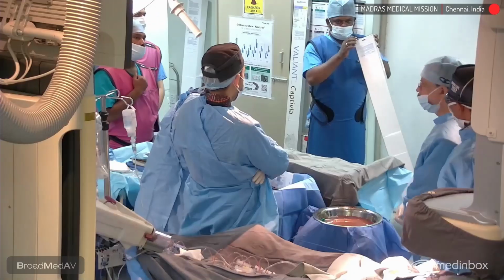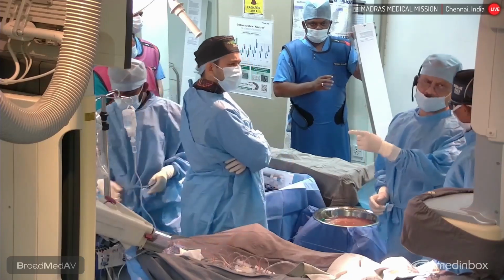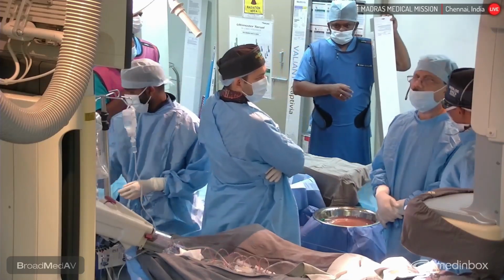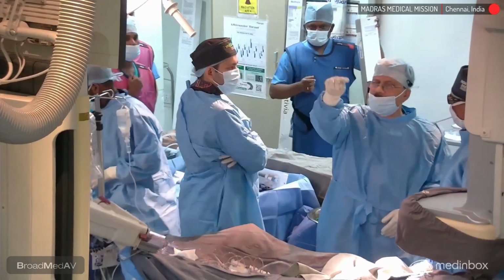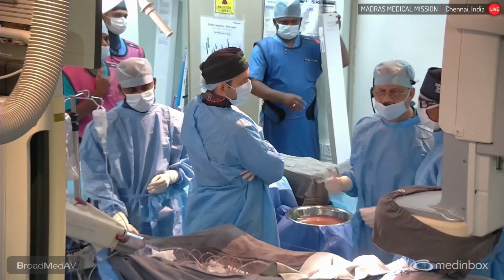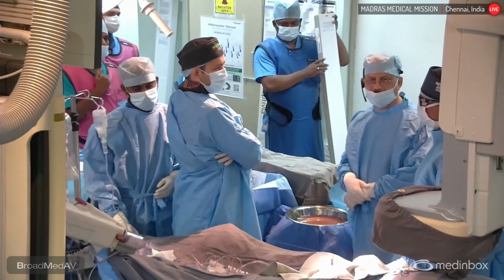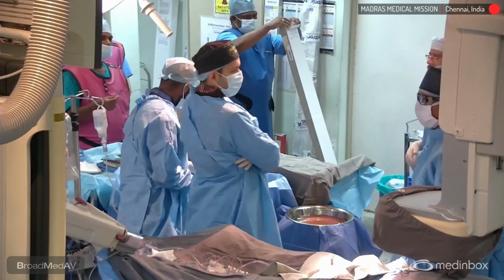I think for the device, we need to change the wire to a Lunderquist wire. No, this is Amplatz super stiff. We can take it over it. Okay, right. So the only thing is we'll put the wire near the valve and then take this device. Lunderquist is stiff enough to take this device.